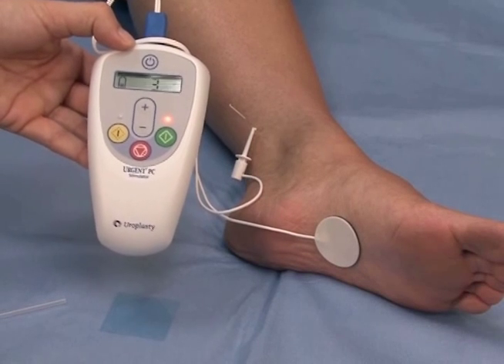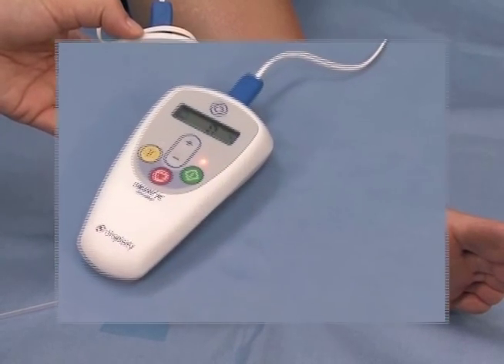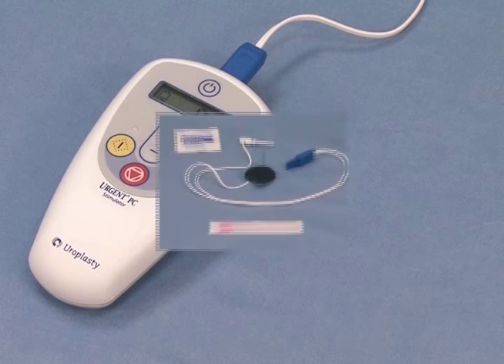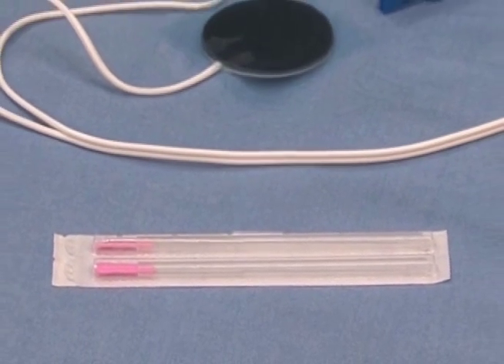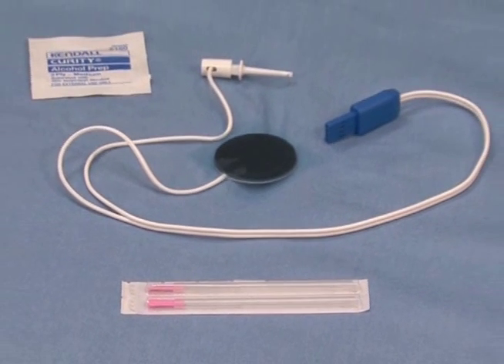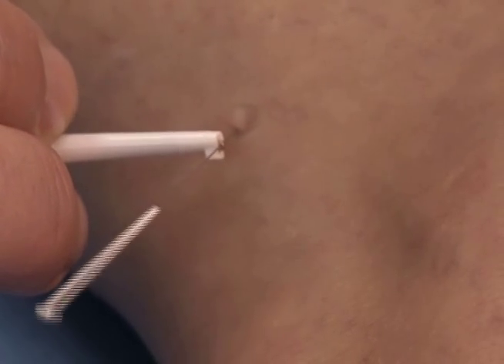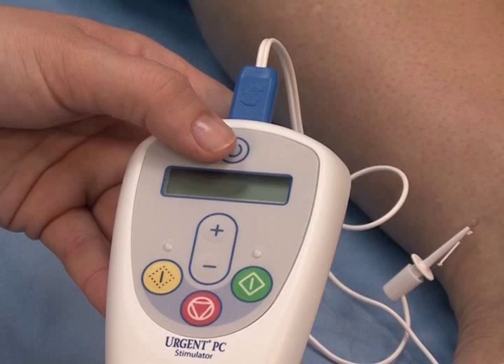The Urgent PC system is a combination of the Urgent PC stimulator, which delivers electrical impulses, the needle electrode, which transfers the electrical impulses to the tibial nerve, and the lead wire, which connects the adhesive surface electrode, needle electrode, and stimulator.